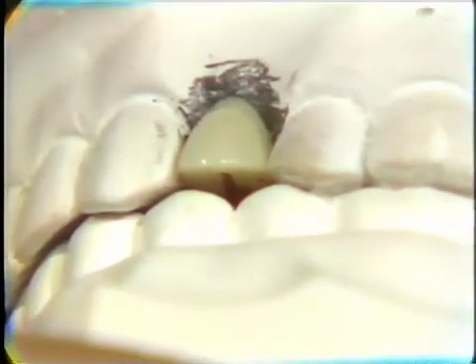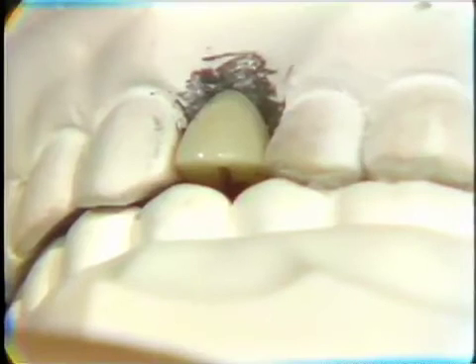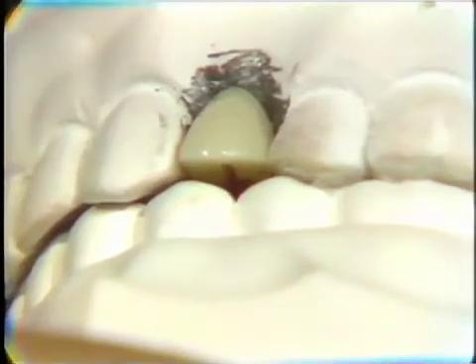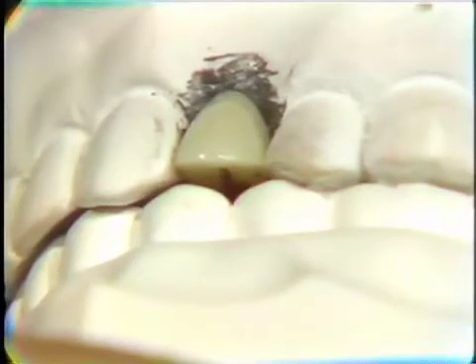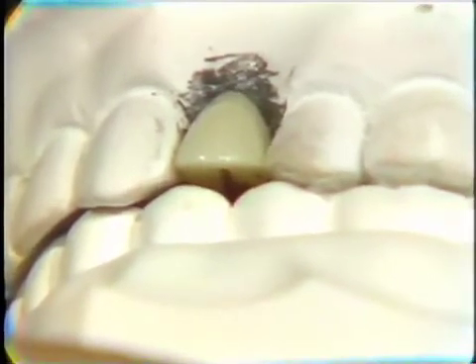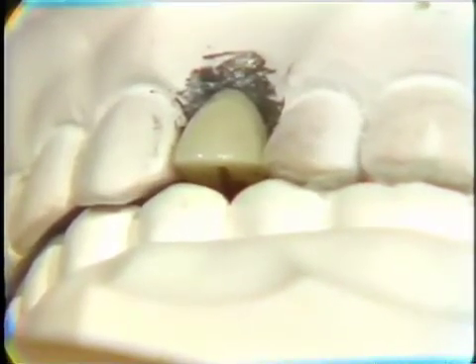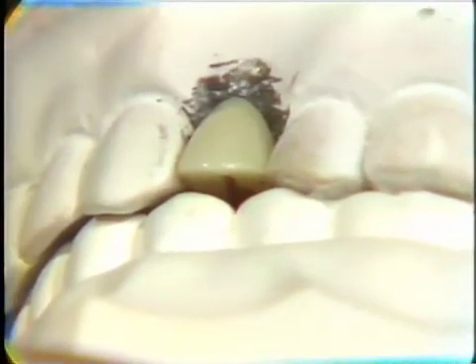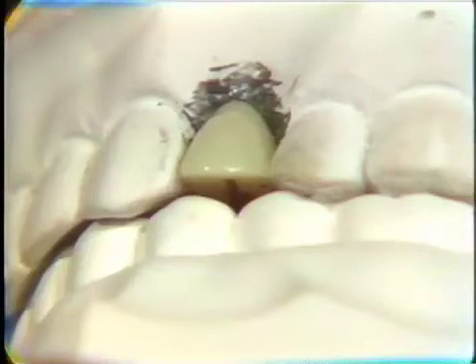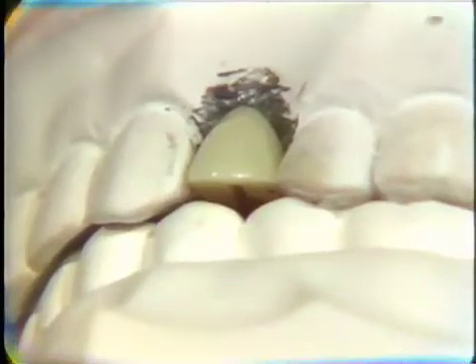And on a clinical case, of course, where this was mounted on an anatomical articulator, you would go out into lateral excursions and ensure that this same spacing existed in all extents of that excursion. We can't do that in this particular handheld situation. So we merely make sure that we've got enough room in there for the occlusal surface to be developed.